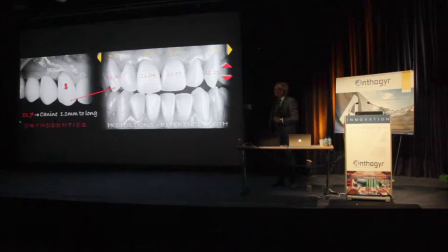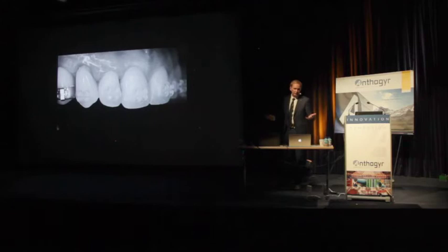And here I decided to treat this case with an additional orthodontic treatment, a fast orthodontic treatment of 3 months only to extrude this canine to make it shorter. Hopefully also some of the bone would come down with the extrusion of the root and the tooth. And also the tilted midline could be corrected. And here in the frontal area, with the central incisors, I could obtain an improvement. So you see a small overlap, small recession, and that's what the orthodontic treatment did.